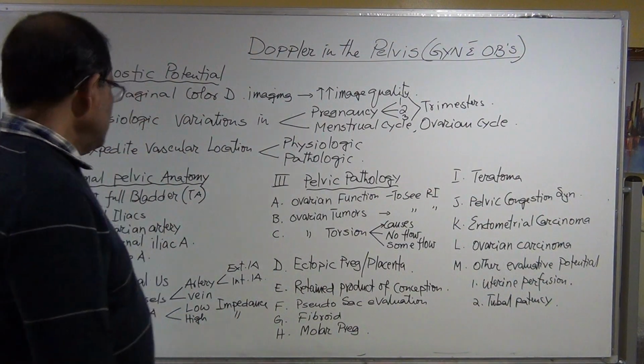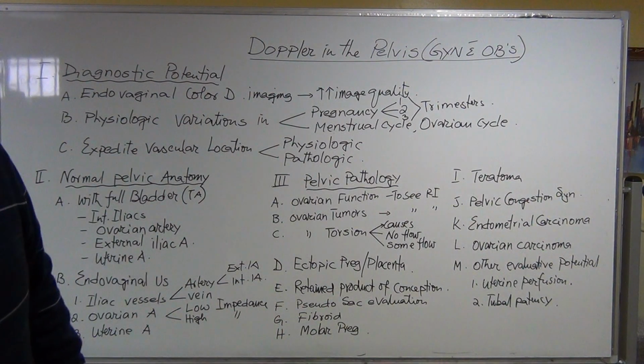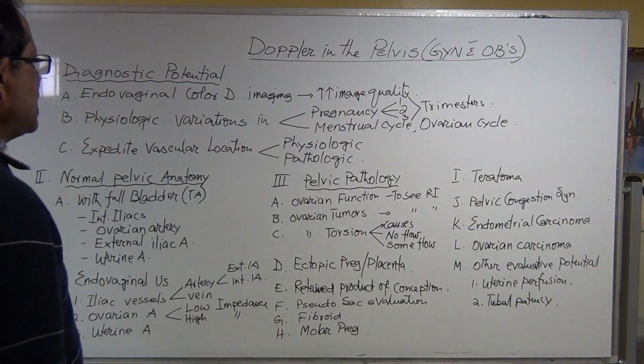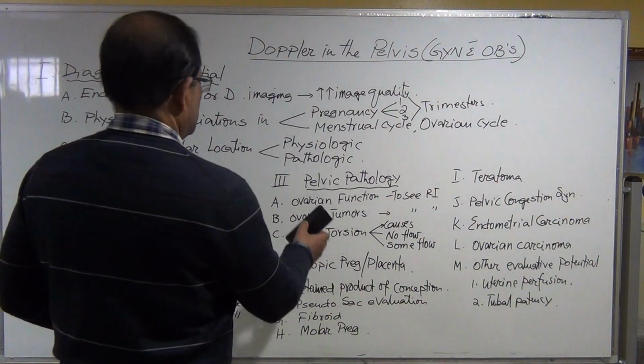Okay, so now one thing I want to mention here, a couple of things with the diagram. Okay, so now I will take certain parts out.